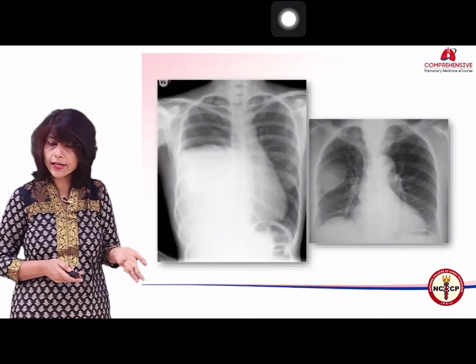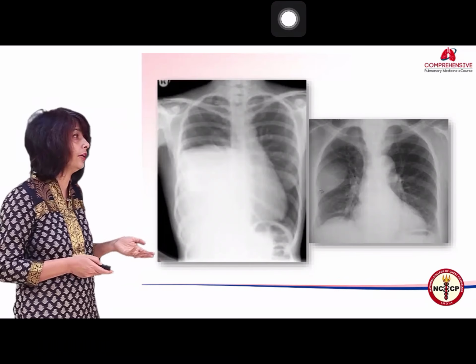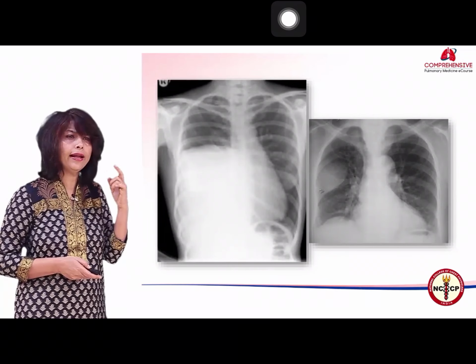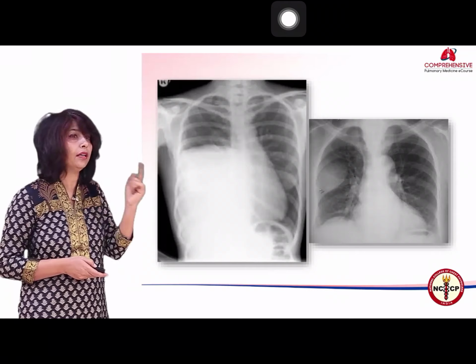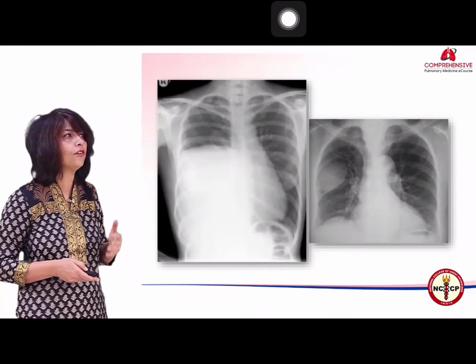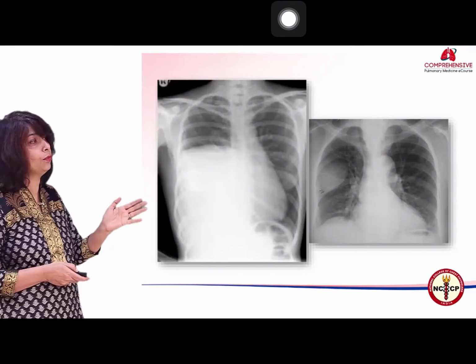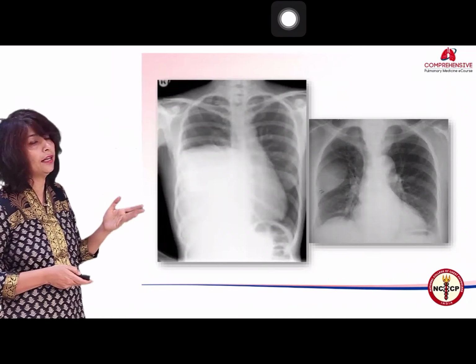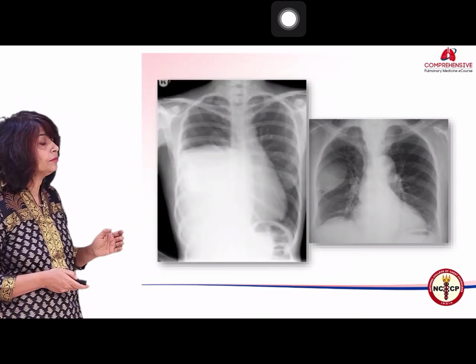And what should I do next? I should do an ultrasound next. So that is how it helps, because it helps you to suggest the next modality. The next modality can be an ultrasound, it can be a lateral radiograph, it can be a CT. It's not the same for everybody. That's why I have to make up my mind on a chest radiograph, and I can't say that it doesn't matter. I have to do a CT in any case.